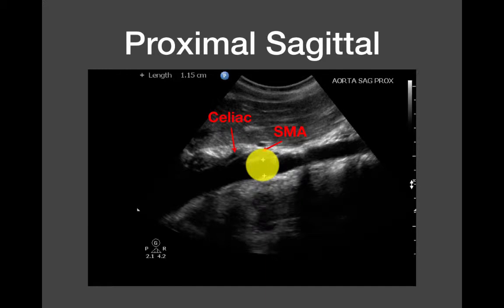So this is actually a very important view, and this has to do not with what we do, but what the vascular surgeon has to plan for when we call them about these patients. When we take care of these folks, we make the diagnosis, we do the initial resuscitation, we call the right folks, i.e. vascular surgery, and our job's done. We high-five each other and the patient gets whisked off to the OR. Obviously, the vascular surgeon's job is just starting.